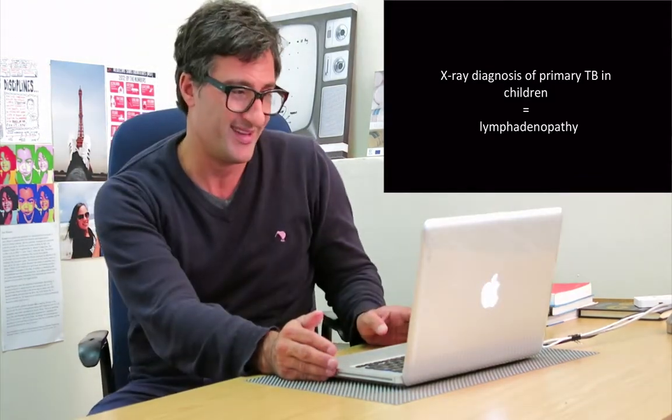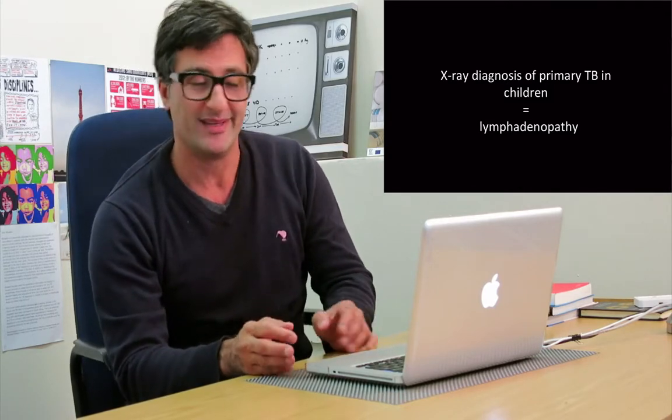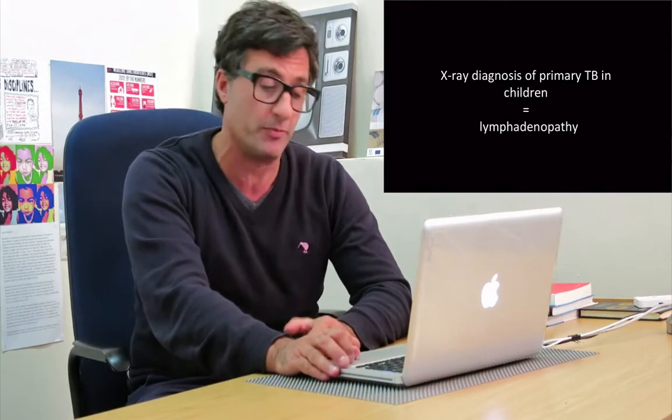So that brings me to the main point of the lecture today, that the diagnosis of TB on the X-ray in children is identification of lymphadenopathy, and that's easier said than done. So I want you to concentrate on the obvious findings and not worry if you can't see, because there are other diagnostic things that are going to happen on the ground in the clinic. If you're going to pretend there's lymphadenopathy rather than be sure that there's lymphadenopathy, it's probably not going to work or help you in any way.